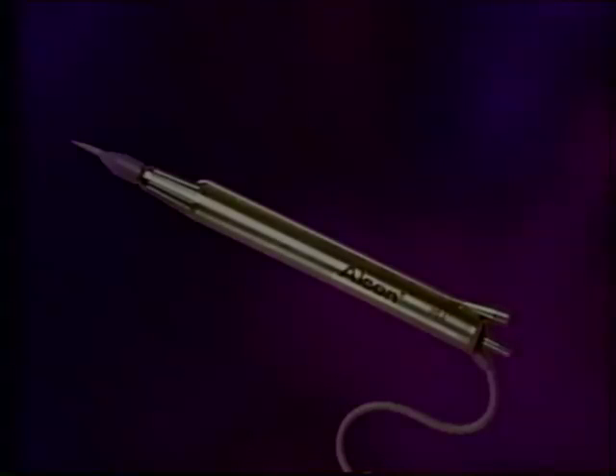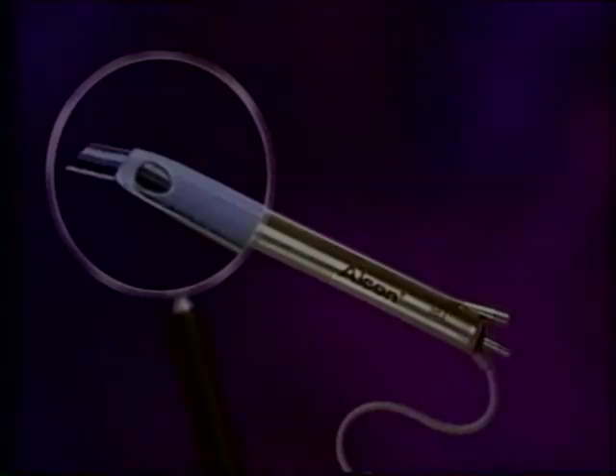My current technique has evolved over the past several months as a result of utilizing the Alcon Series 20,000 Legacy and the 30-degree Kelman bent tip. Using downslope sculpting, the angle of the Kelman tip helps to quickly reach the posterior pole of the lens for safe, efficient, and multi-directional fracturing. The Series 20,000 Legacy enables me to maximize my parameters for more efficient use of ultrasonics and fluidics, and facilitates my multi-directional divide-and-conquer.